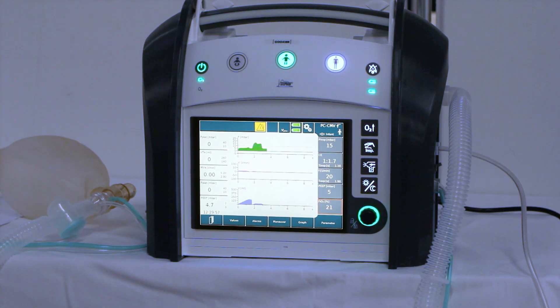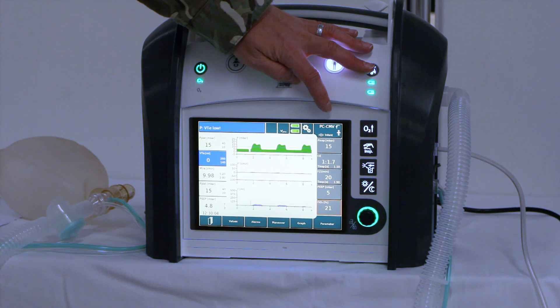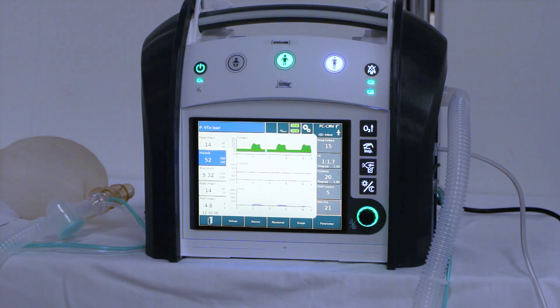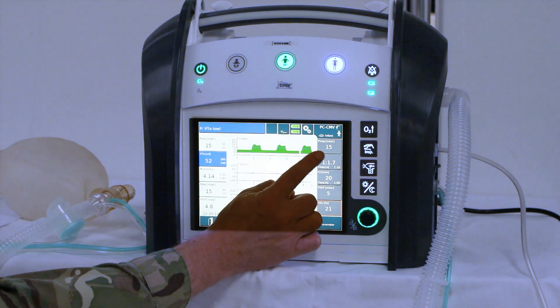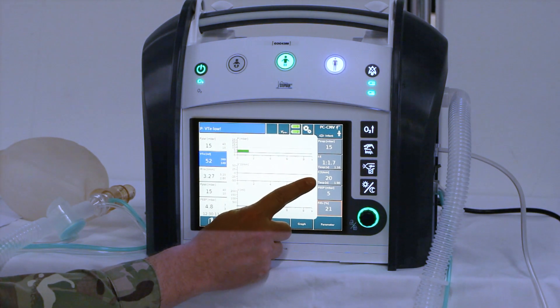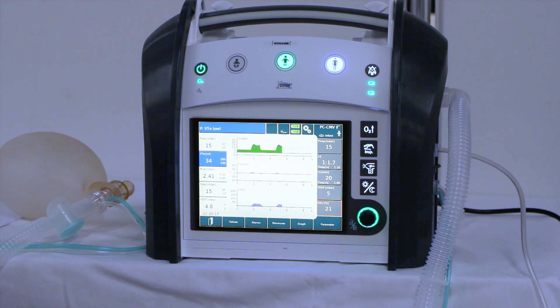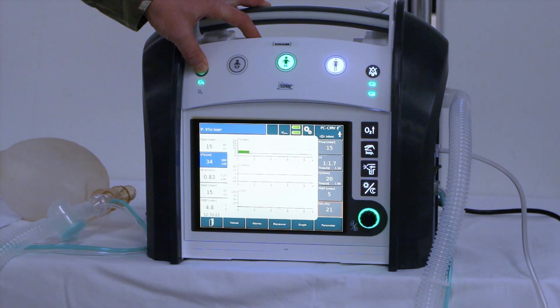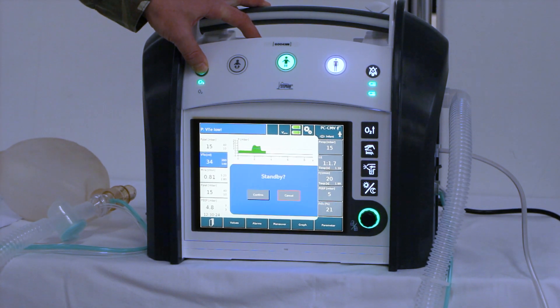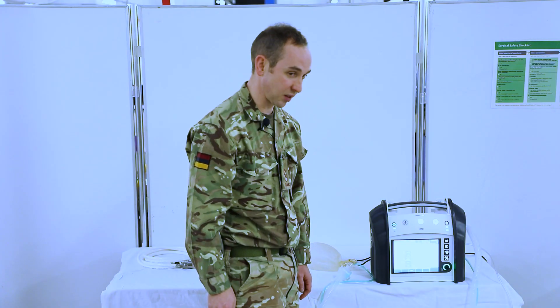At this stage, we need to check that our settings are correct. We should have pressure controlled, controlled mandatory ventilation — this time without PRVC selected. We should have an inspiratory pressure of 15, a frequency of 20, and a PEEP of 5. Once we've confirmed those settings, put it back in standby mode — press and hold the power button until the blue alarm menu comes up, click confirm, and it's back in standby mode.